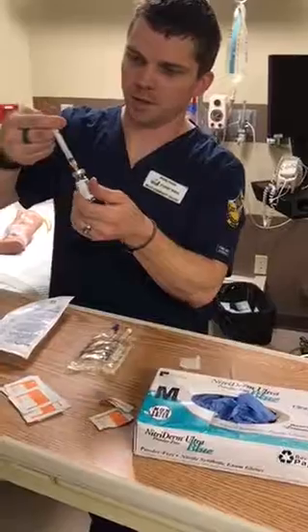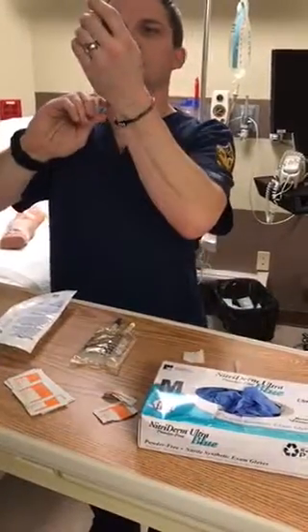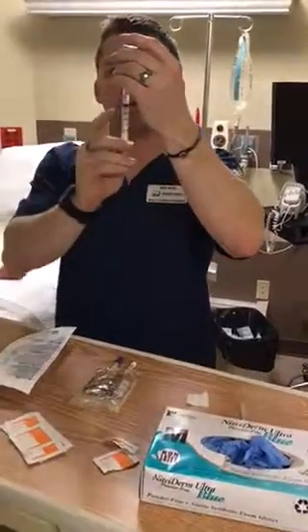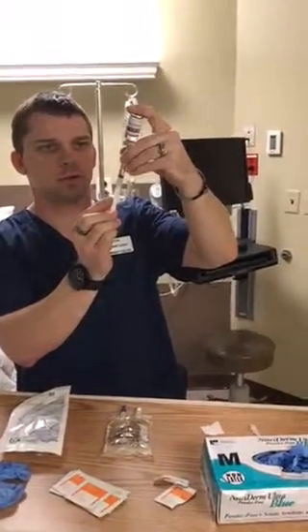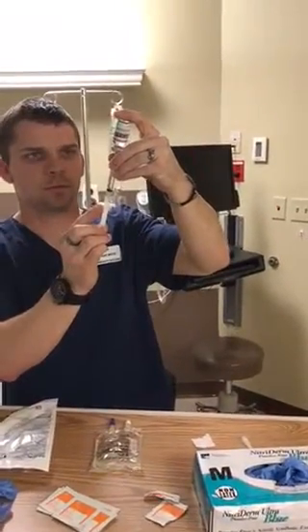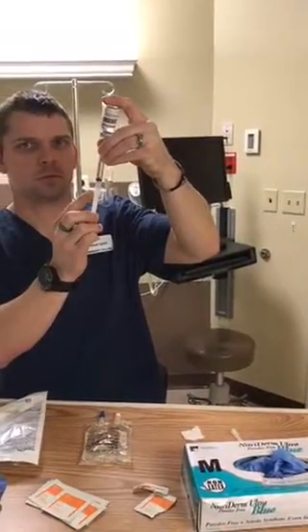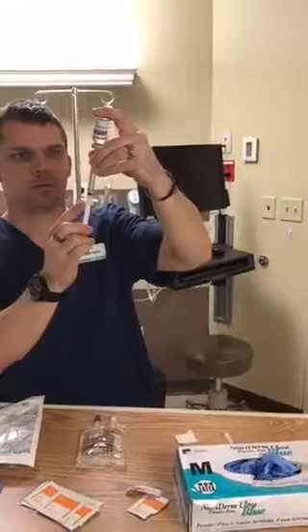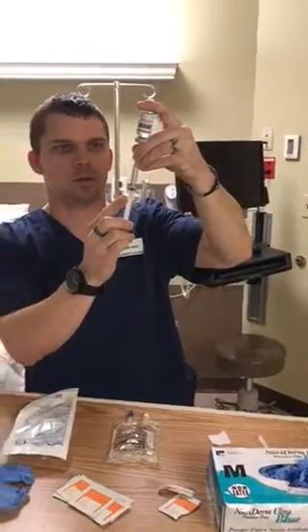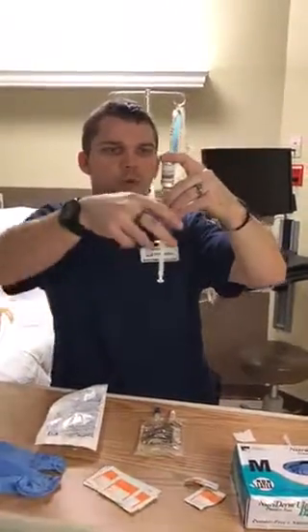Instilling 3 milliliters of air into my vial. Turn my vial over. Pull 3 milliliters of Practivile solution out. Right there. Okay, that's a little bit more than I need.